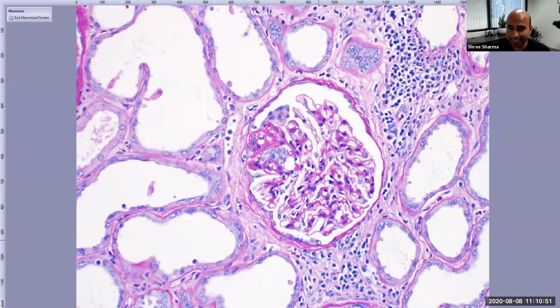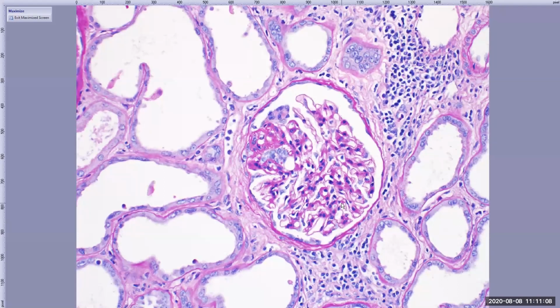It does matter what is in there, because I will go gradually and show you different morphological variants. Depending on that, it will matter what is there, but not exactly. Obliteration of the tuft, you can say, is sclerosis. That is the start. Ganesh Srivasa has an interesting question: at this point, can you differentiate this from nodular sclerosis of diabetes or another entity?